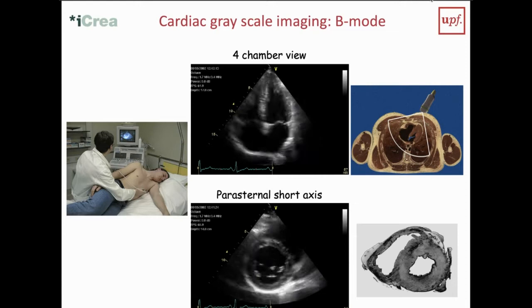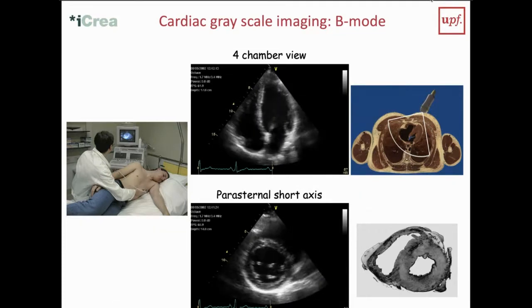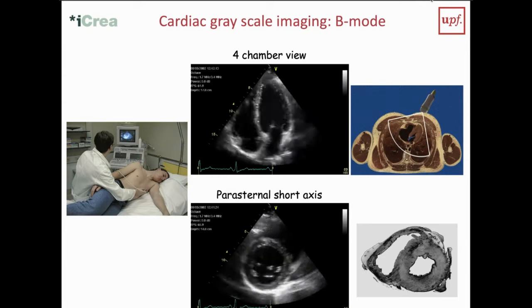And so the space an adult person has is about 1 centimeter between two ribs. And what also is the case is that very often the cardiologist puts a probe on and then pushes a little bit in between the ribs so that you actually push away the ribs. But you really have to go in between. So it's the spaces, what we call the intercostal spaces. So the spaces between the ribs are actually being used for imaging. So that's quite important.